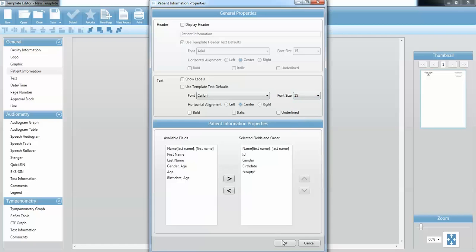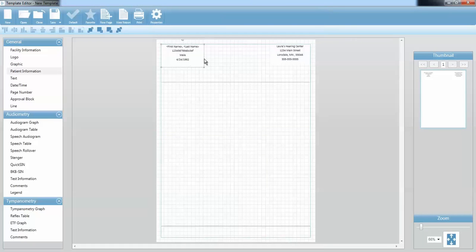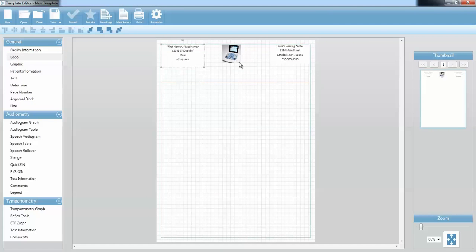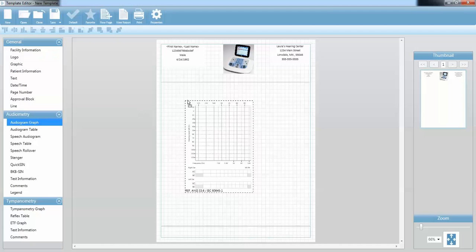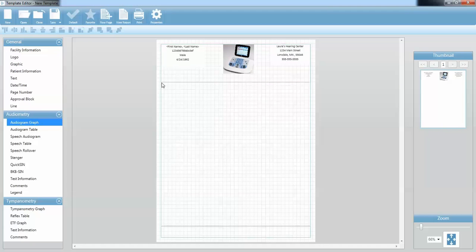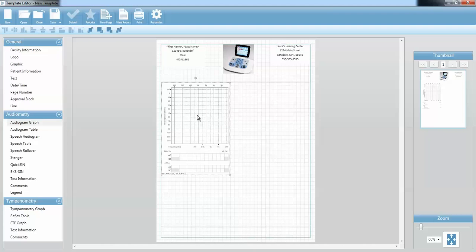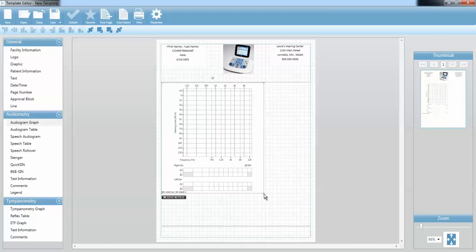I'm going to make this font consistent with my facility font — change the font and the font size and press OK. So now I have consistent patient information and facility information. Lastly, I need my logo, so I'm going to drag that over, place it right in the middle, and make it a little bit bigger. That's how I would like the top of my report to look every single time. Now I'm going to get into the rest of my data — I'm going to grab my audiogram graph and place it on my report. Just like the facility information and patient information, when you select this component it turns into a picture and you can resize it as big or as little as you want.